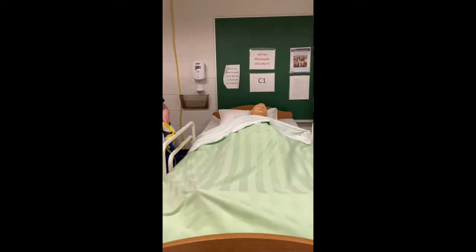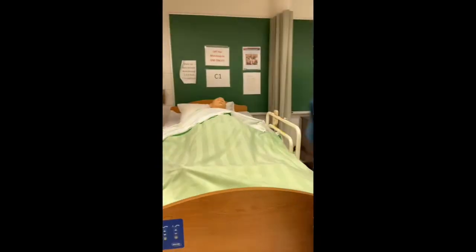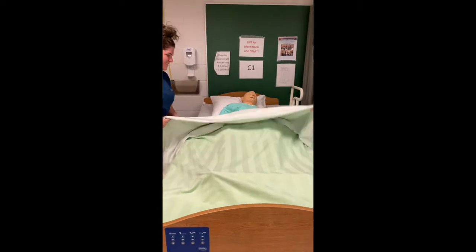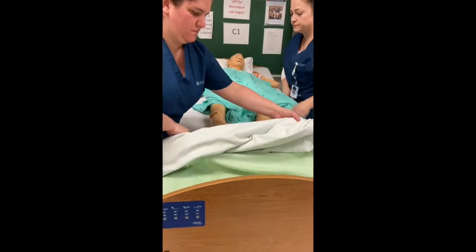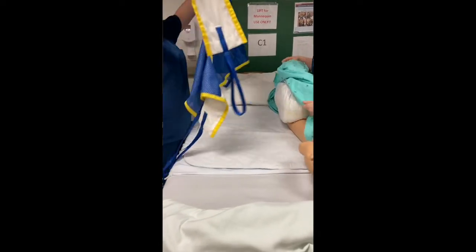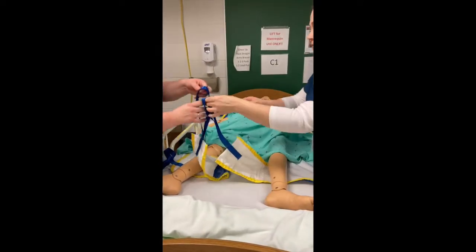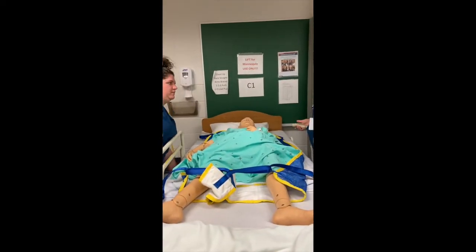I obtain the mechanical lift harness and place it under the patient while he is turned toward Abby. We ensure the harness is comfortably under the patient and arrange the straps by crossing them through the appropriate channels. I raise the head of the bed to a 90 degree angle as Tiffany brings the lift down to reach the straps.